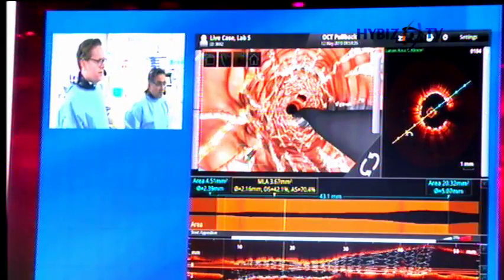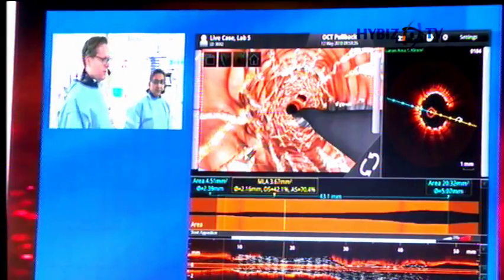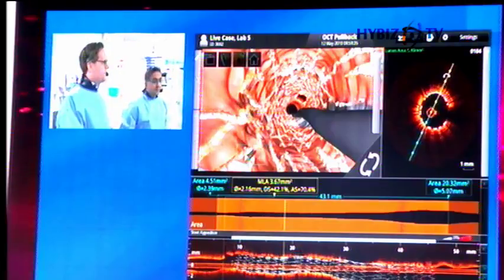That's it. If you look at the stent at the bottom there, you can see that despite the irregularities within the wall, the stent doesn't rip the vessel out of the way or force it. It actually conforms to the anatomy of the vessel, which is why we like it, because it's gentle, and yet you get this phenomenal stent apposition.